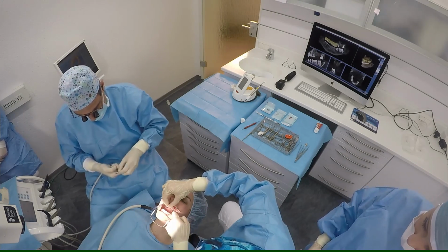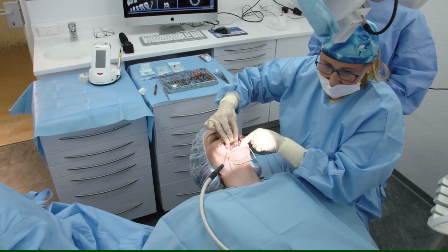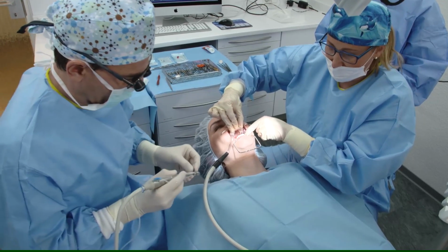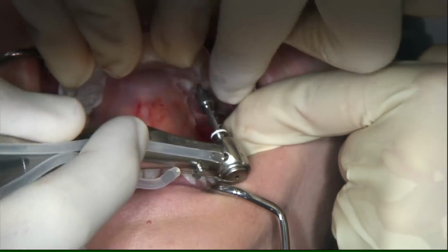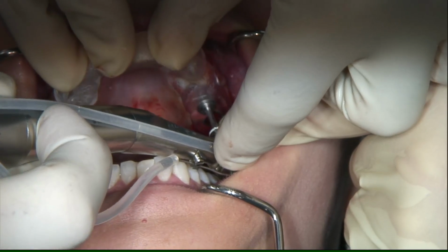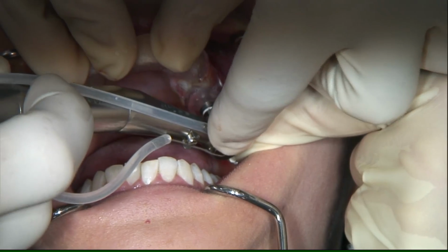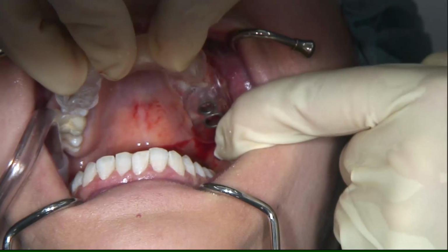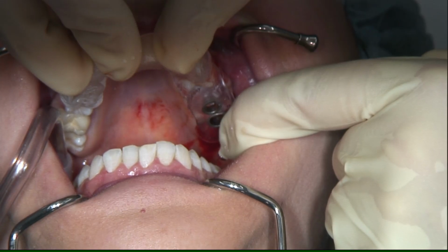Without any bone augmentation, any sinus floor elevation, we have enough bone. So area 2.5 we are planning 11 millimeter length. Area 2.6 we are planning a 9.5 millimeter length. But we know from many studies, such as from Weigel 2010, that also implants shorter than 10 millimeters show similar results to longer implants, so we don't need a 15 millimeter implant here.